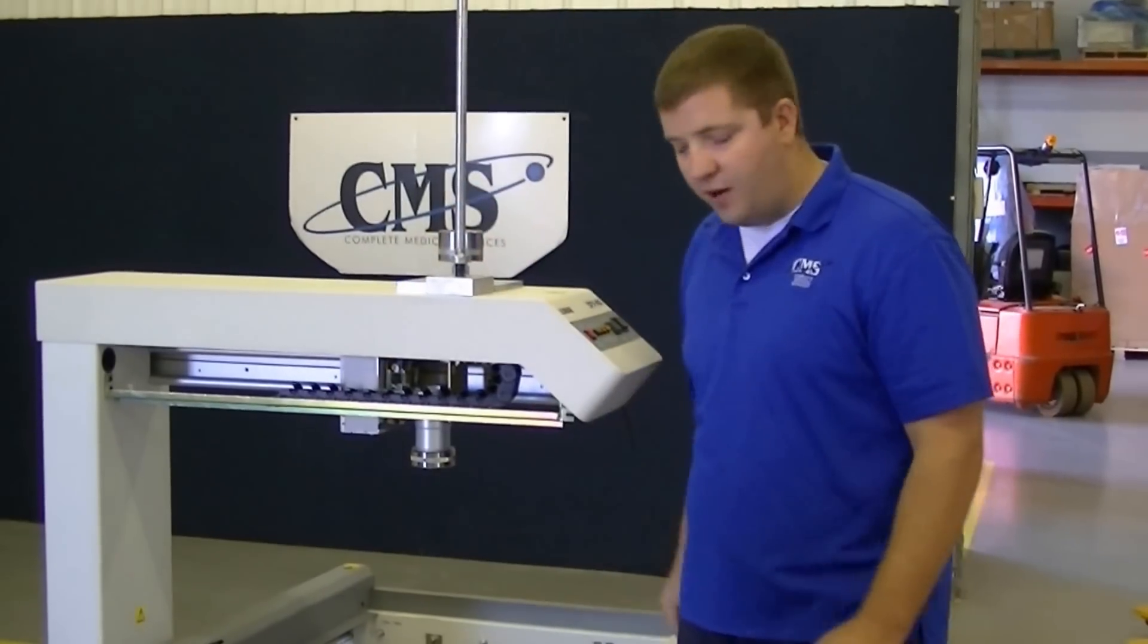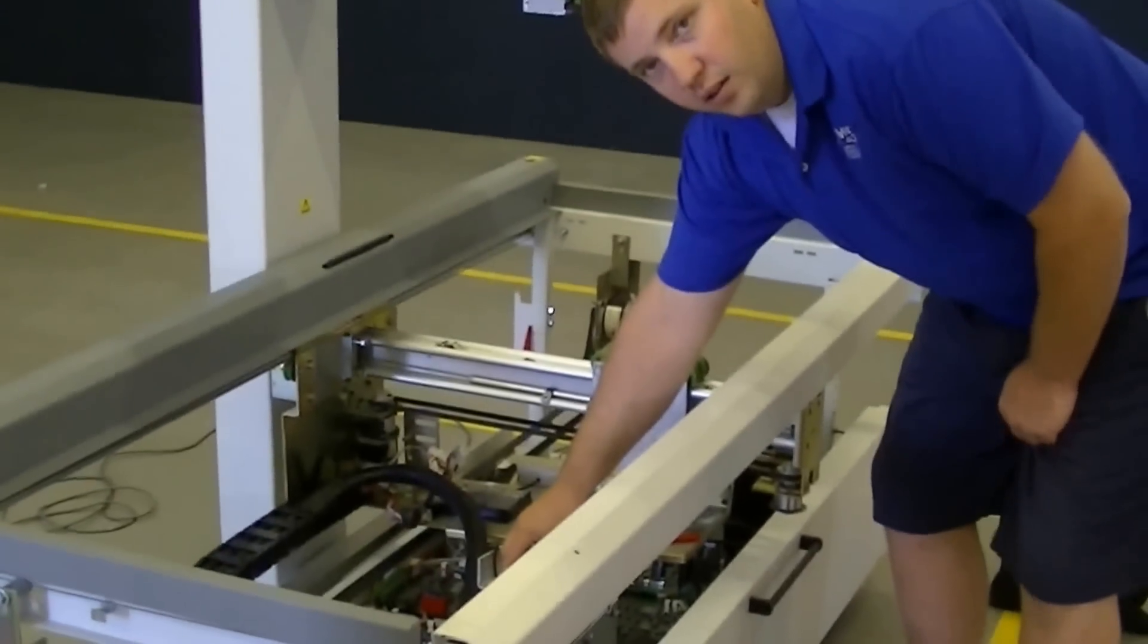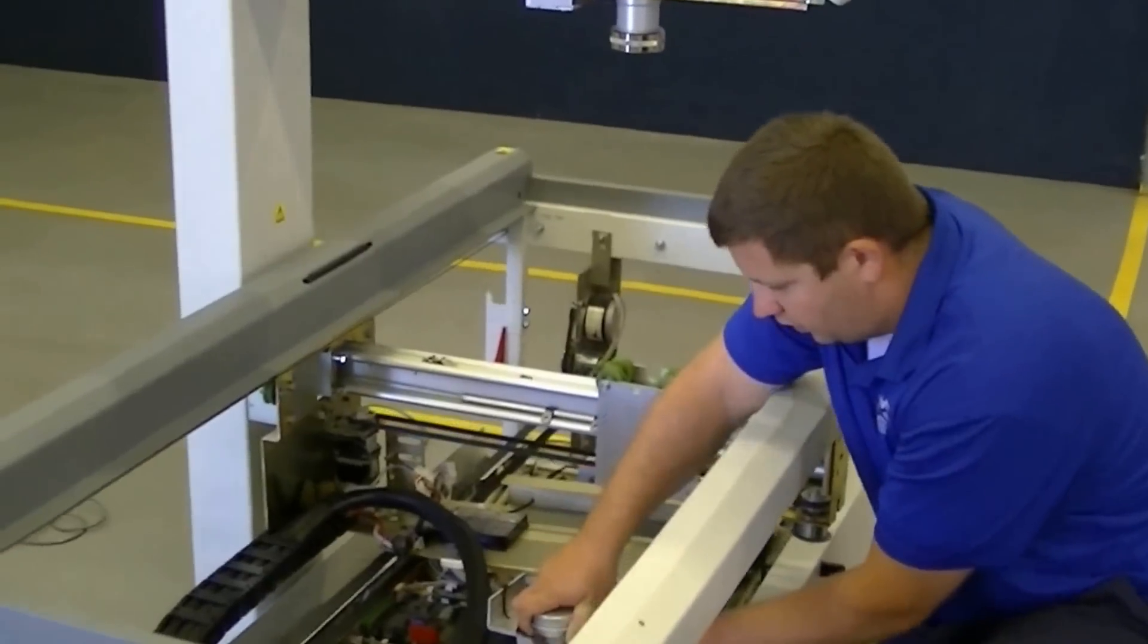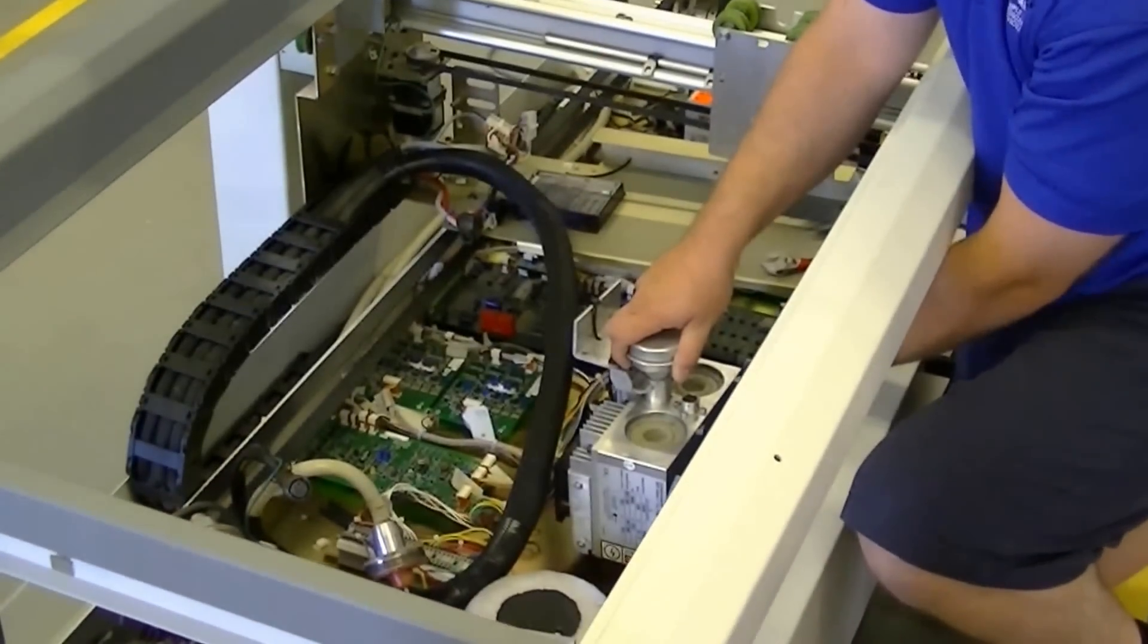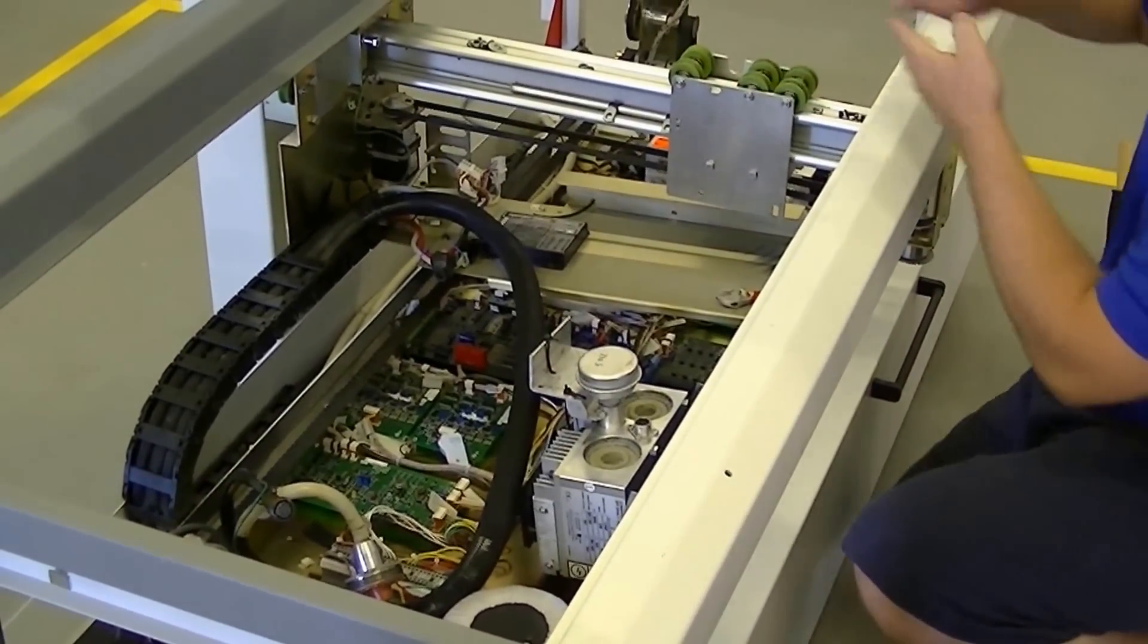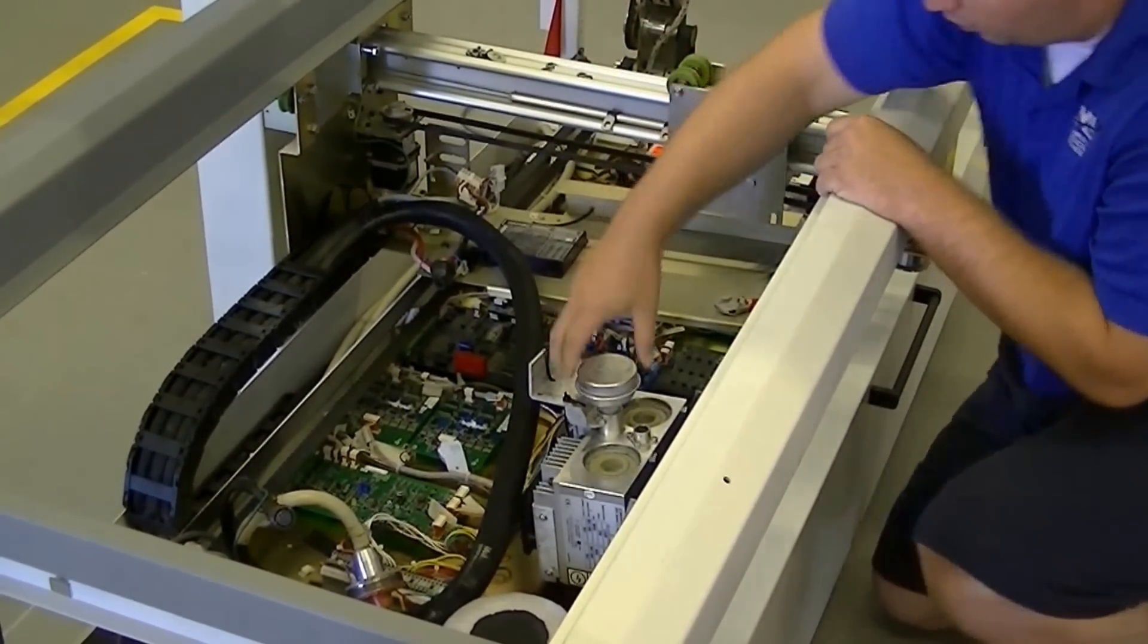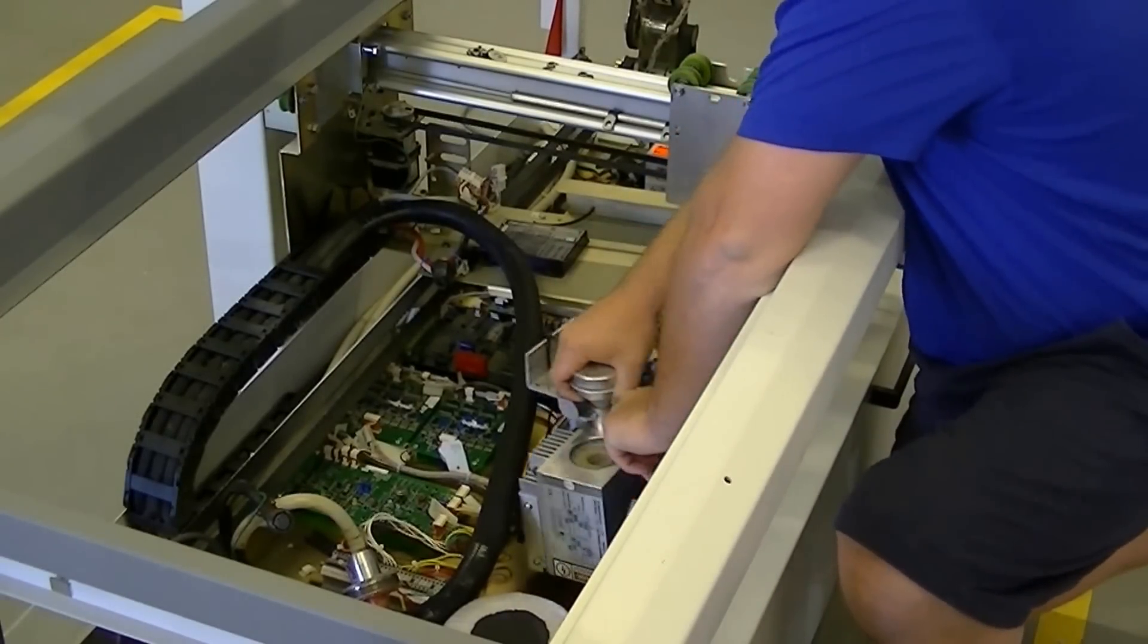So first things first, we'll start off by undoing the bracket that the tube is held in. When you first get the system, the tube is mounted on this bracket. You want to pull the bolts off, set them up here, and then you're going to want to flip the tube once you pull it out of the bracket.